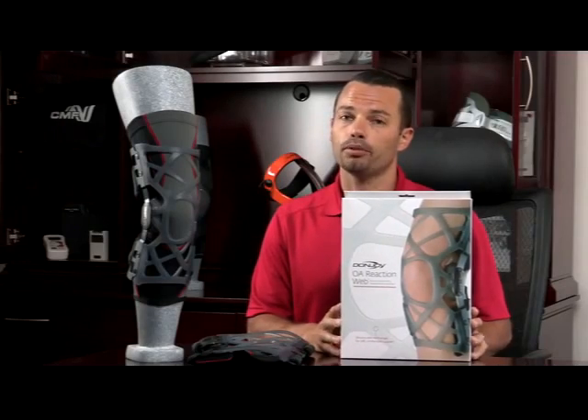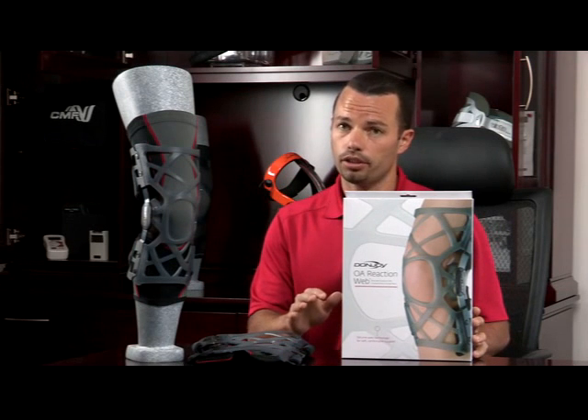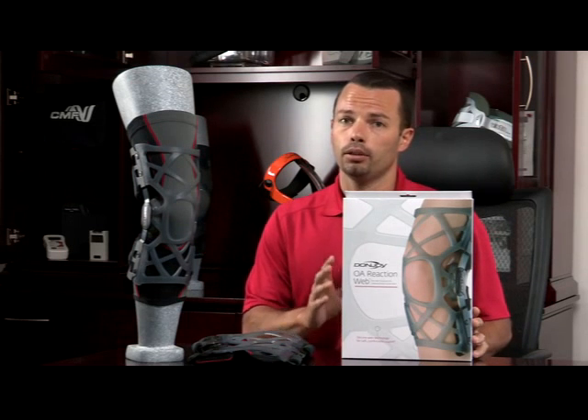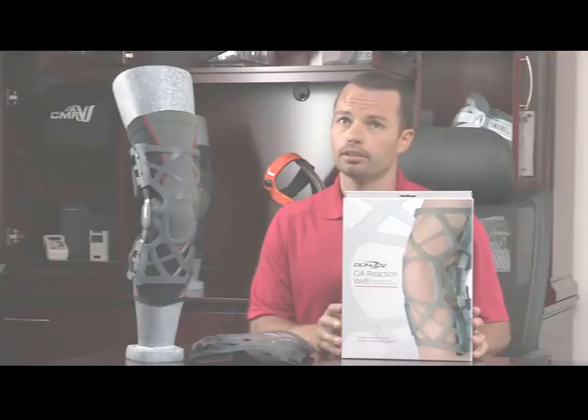This is a new product we developed for osteoarthritis of the knee and early cartilage degeneration of the knee that causes pain or swelling. This is a new low-profile product that you can put on your knee to help you get back to activities. The OA Reaction was created to be a simple and low-profile solution to get you back to activities, and I'm going to show you how this works.